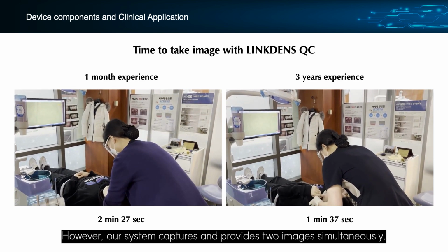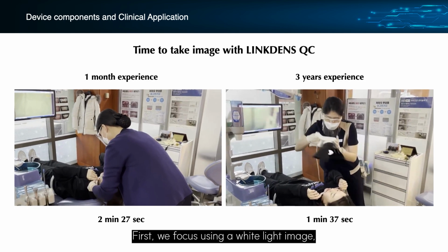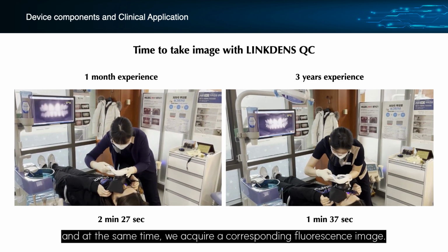However, our system captures and provides 2 images simultaneously. First, we focus using a white light image, and at the same time, we acquire a corresponding fluorescence image.